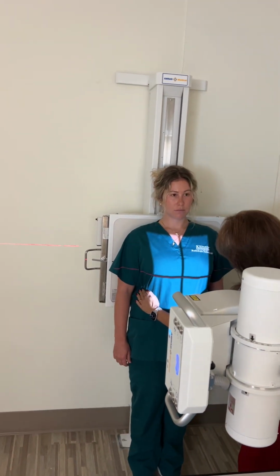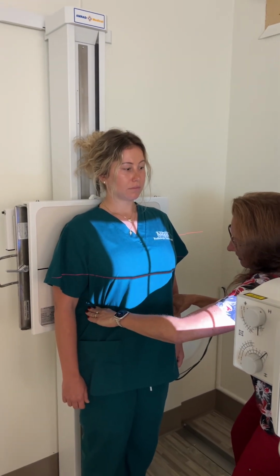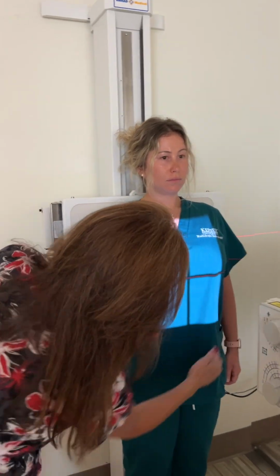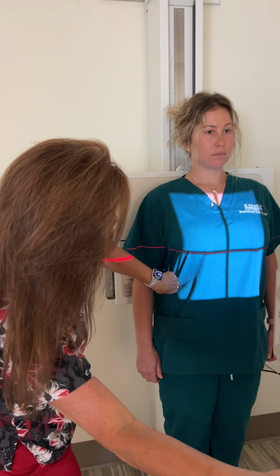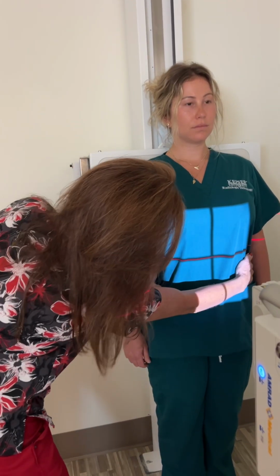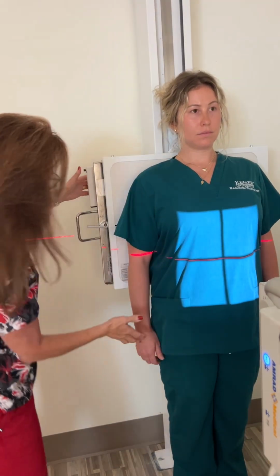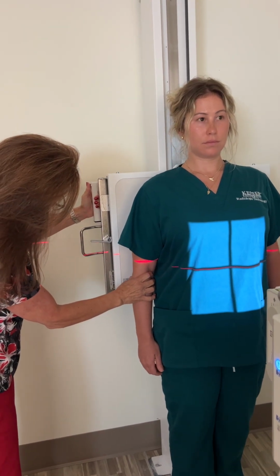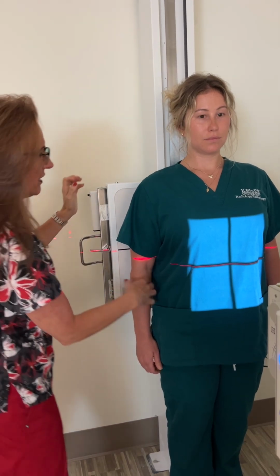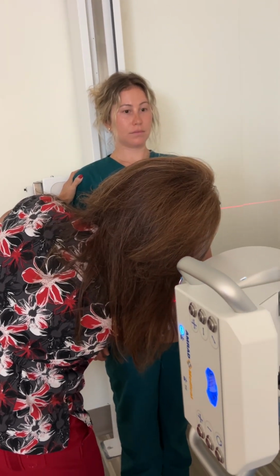And then I'm gonna find iliac crests, which are right here. And then I'm gonna go 2 inches above iliac crest. So 3 of my fingers is 2 inches. So I'm gonna bring this down to just above my fingers. So iliac crest, 3 fingers, I'm right there. Then I move the tube, so I'm gonna move the bucky down so that that's aligned. And I'm in detent. Just make sure she's in the middle, just like that.